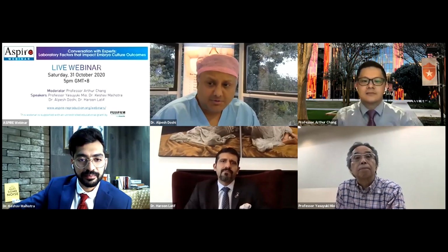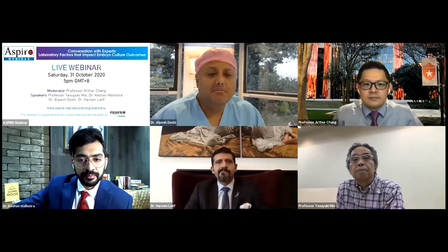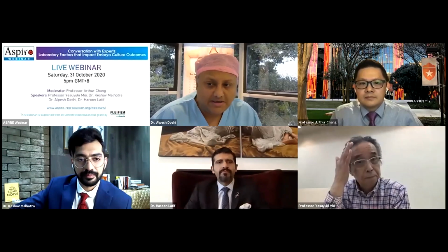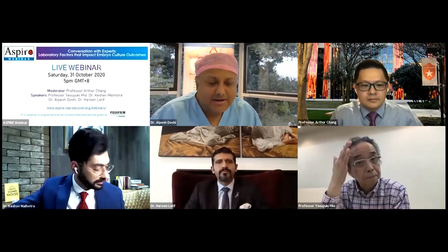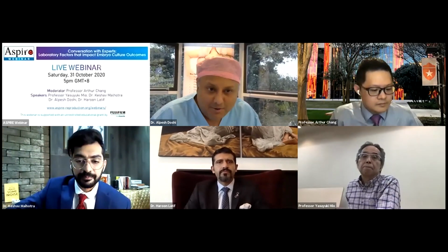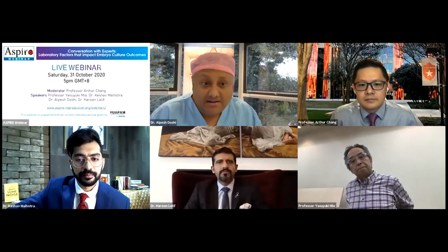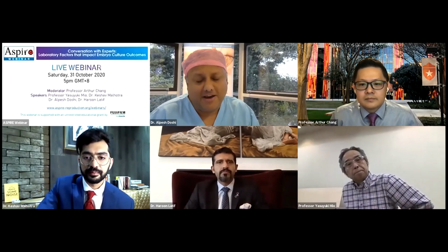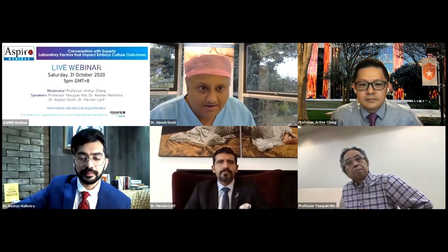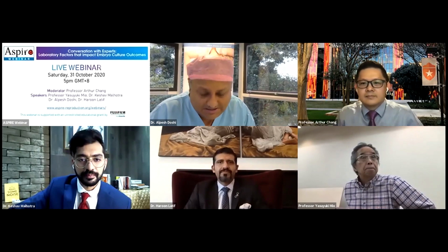So both are very, very good questions. Currently, as the technology stands, PGT is still done by an invasive process, such as a biopsy. We understand that we are trying to look at the inner cell mass and the health of the baby. So why are we biopsying the trophectoderm, especially when we know that confined placental mosaicism exists? To a certain degree, I believe we are all mosaic. There are always going to be mosaic cells in our body, and why not at the embryonic stage?